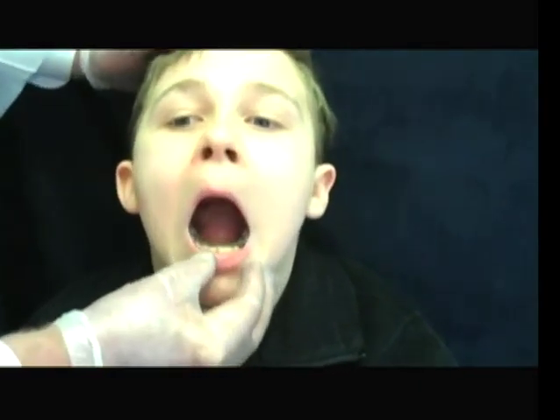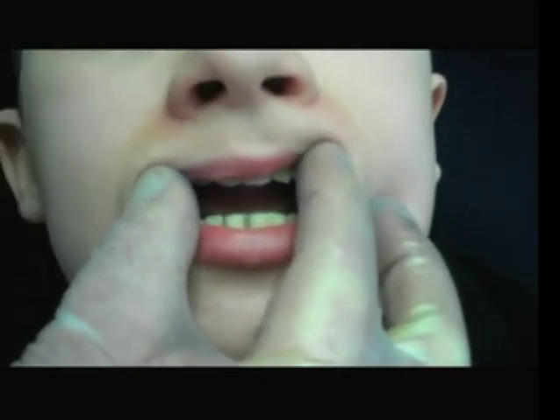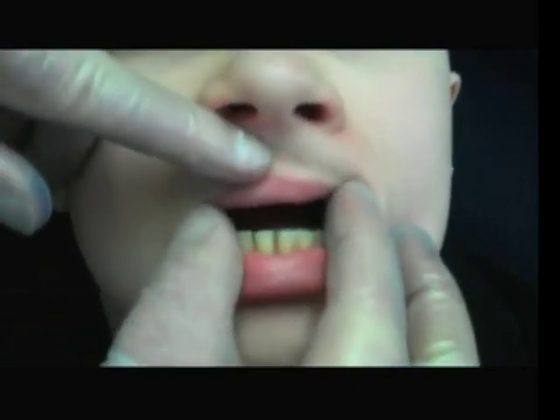Okay, this young man returns after 4 months because he lives so far away. He's been under the care of another TMJ specialist out in his local area, and we rebuilt his splint today. Take a look and bite. You can see how tall we made it here. It's about 6 or 7 millimeters high. Don't be afraid to make them this thick. We made it this thick to compensate for the long intervals at which we see him for the wear and tear.